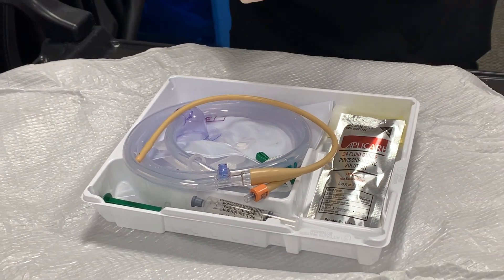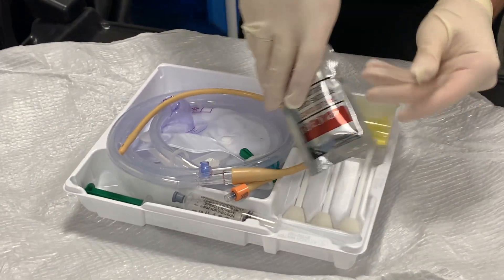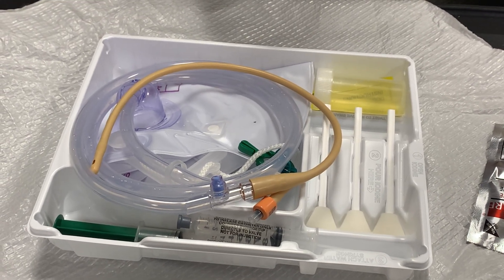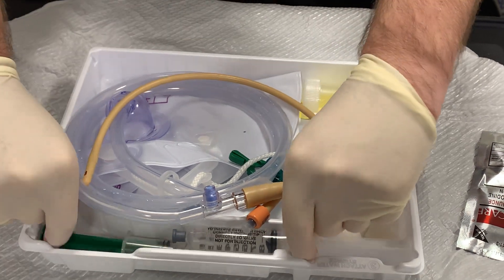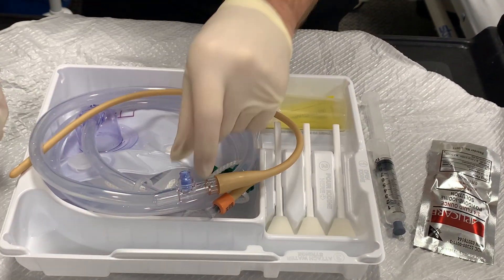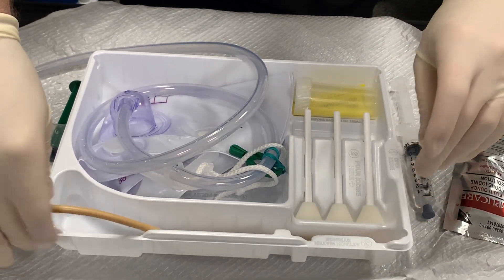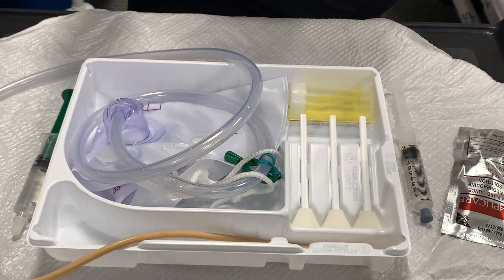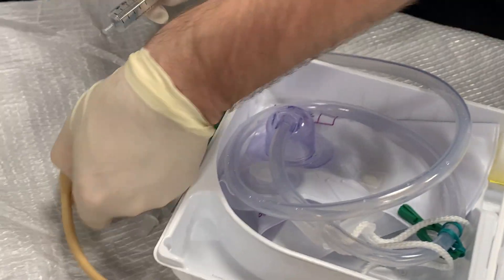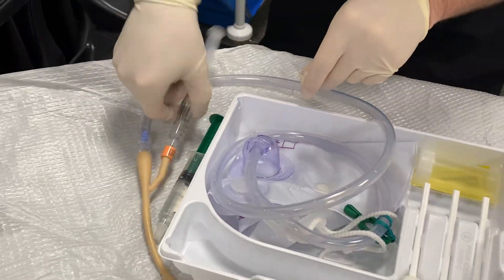Next, we will take our betadine and pour it into the catheter tray, making sure the person for whom we're changing the catheter is not allergic to betadine. We would then take the lubricant included in the change system, lay the catheter on the lubricant, and move it up for insertion. Then we would take the included fluid syringe and attach it to the balloon port. Now we're ready to clean our urinary opening and insert our catheter.